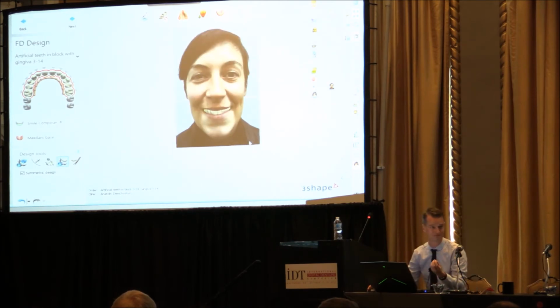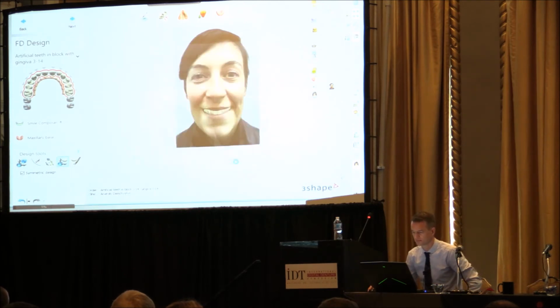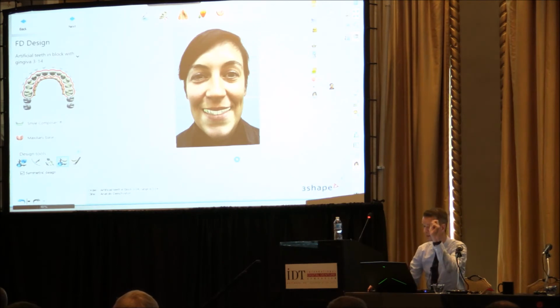And it's really cool. Remember Lee Kolb's comment yesterday in the panel discussion on fixed: every good lab that does a big fixed case for anteriors does this today. You go on Facebook, you see hundreds of pictures of people doing this on fixed every day when you do a big anterior case. All right, let's move on. Again, I could have moved the whole thing up and down. I could have sculpted it. I could have changed library if you want more or less square. I can do everything in the face of the patient here.